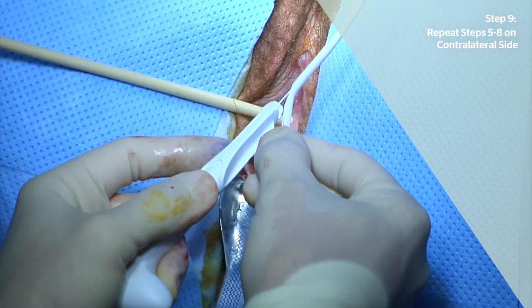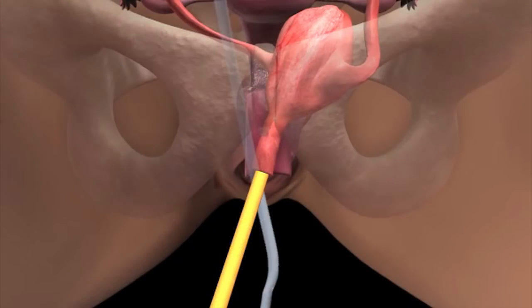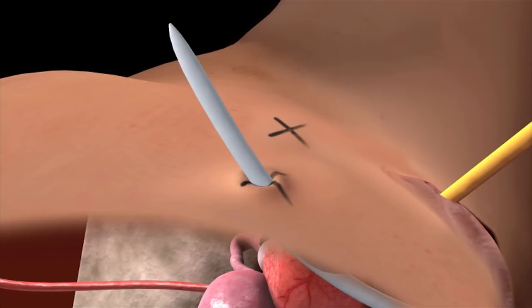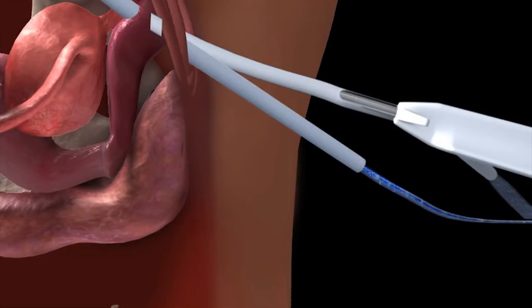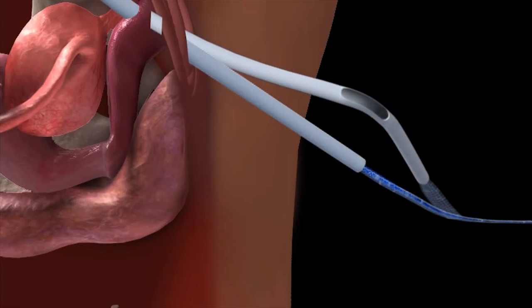Prepare the Gynecare TVT Exact system. Push the tip of the foley catheter to displace the bladder to the contralateral side. Push the trocar sheath tip through the skin. Pull the trocar sheath laterally and off the trocar sheath lock. Carefully withdraw the trocar shaft from within the trocar sheath.